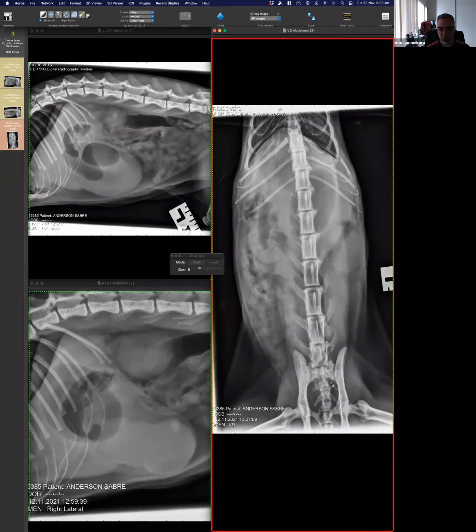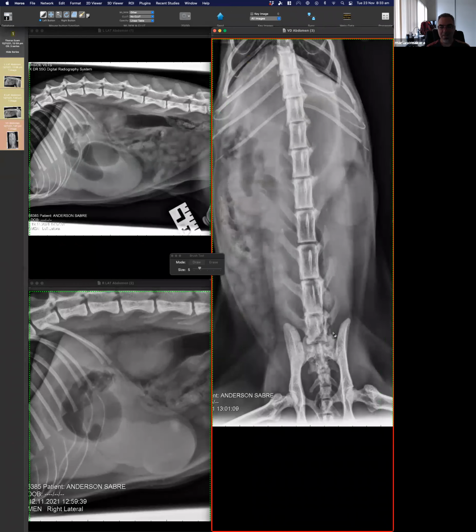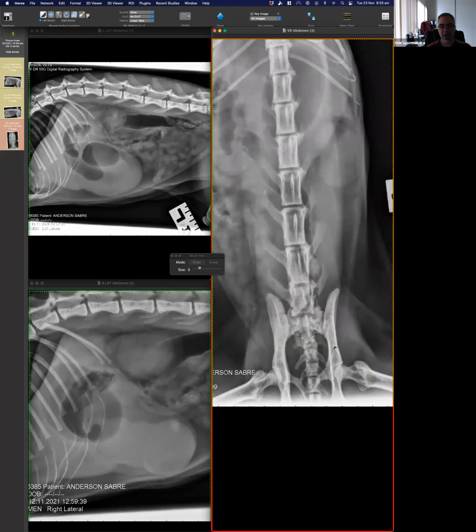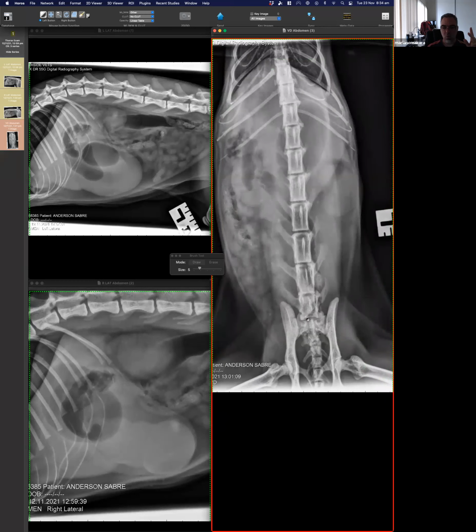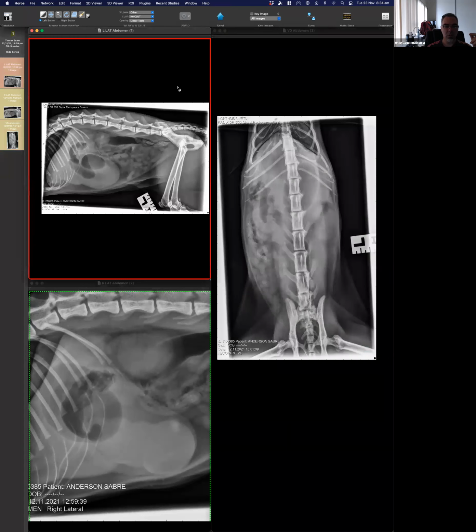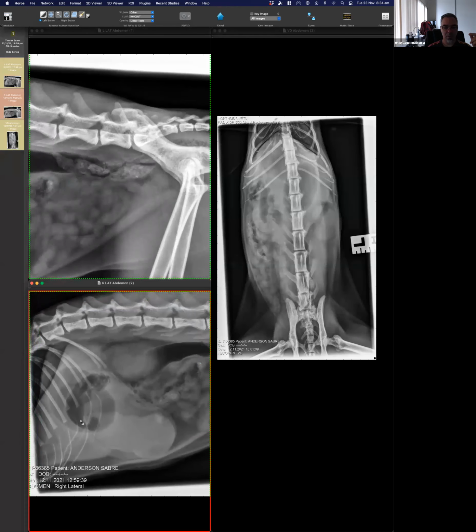I promise I will come back to this comment about it being irregular. I think there we are dealing with a difficult anatomical structure, and I have two points to comment. One is this one. I think there is a little bit of obliquity. I think there is the colon there with the feces and gas, and all of that is producing that. I would probably call it heterogeneous, like irregular appearance. I would really like to come back and see if I see something abnormal there.